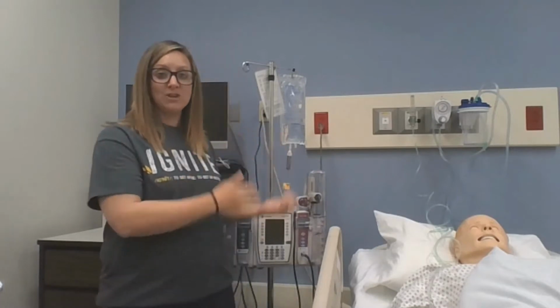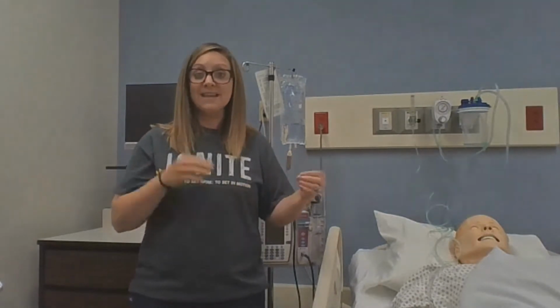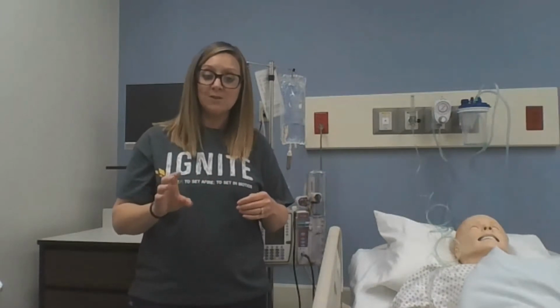They also can't be on oral pain medicine. So you're not going to have a patient that's on this in addition to Tylenol number 3, or also with the oxycodone or something like that. So that's important to note. If there was an extreme case of poor pain management on a patient and the physician required or ordered that they receive maybe oxy in addition to their PCA of morphine or whatever they're getting, it's very important for the nurse to do proper documentation.